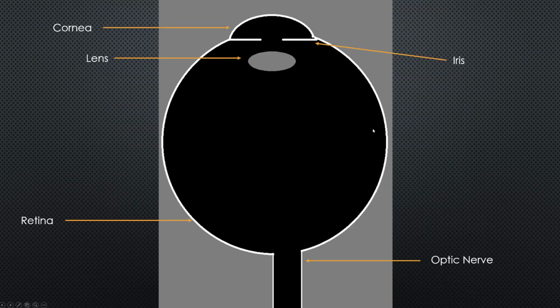So this is the basic ultrasound image that you're going to see. At the very topmost portion, you're going to see the cornea first, which makes sense. You have the cornea, the anterior compartment. And then you have the iris here with the pupil, followed by the lens just deep to that. You have the posterior vitreal cavity, followed by the retina. And then this dark shadow cast behind it. It looks like a shadow, but it's the optic nerve. It's this dark hypoechoic structure.